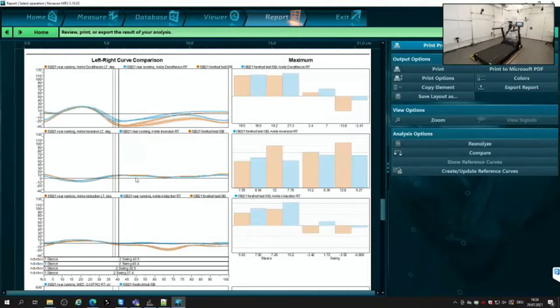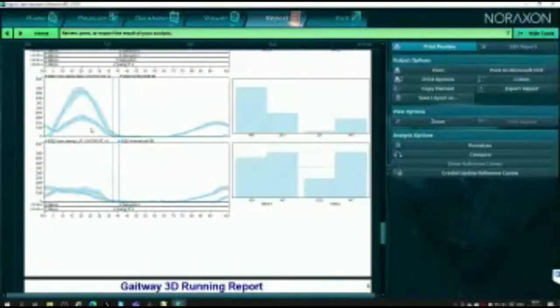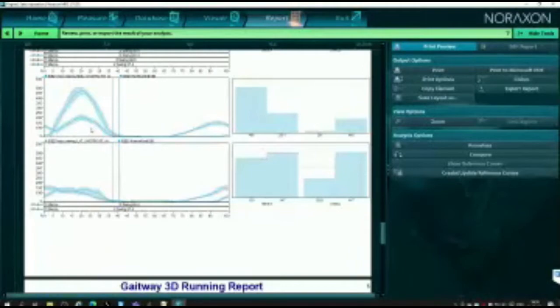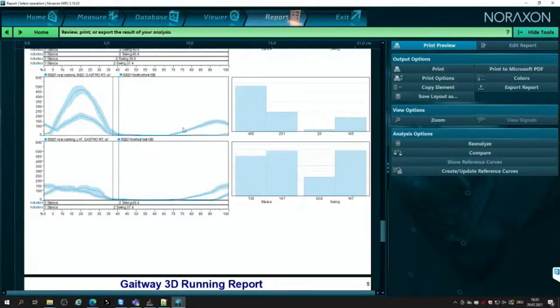In addition to the kinematics, we are also collecting the EMG data, which I believe will also be shown down here at the next page, perhaps. And this is a very interesting portion of the recording, because we can really highlight the differences between the two conditions with this data. In particular, the gastroc that you see there, we get a significant amount of activation during the rear foot running during stance, but in particular, the pre-activation of the gastroc during the swing phase for the forefoot running. And of course, the gastroc is going to help us with that plantar flexion. So during swing phase, as the subject is preparing to land, we're seeing that innervation of the gastroc before the landing is occurring, because they're anticipating that shock absorption with their forefoot during that particular running style.